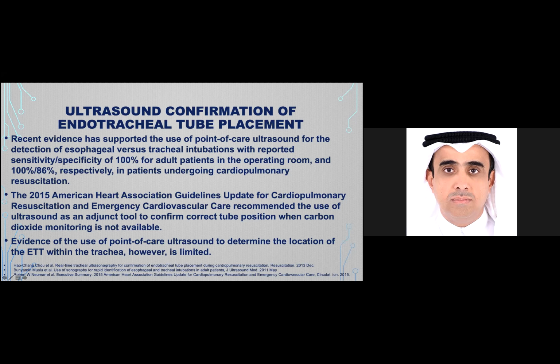It's very, very important to see this. The recent evidence has supported the use of point of care ultrasound for detection of esophageal versus tracheal intubation. You find the sensitivity of this is around 100%.